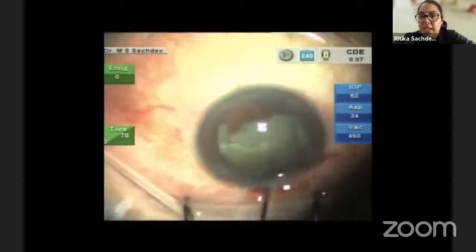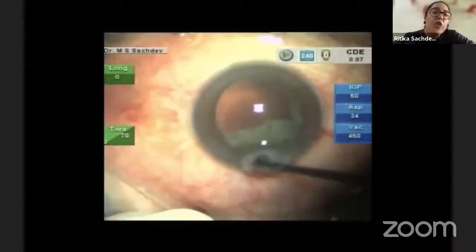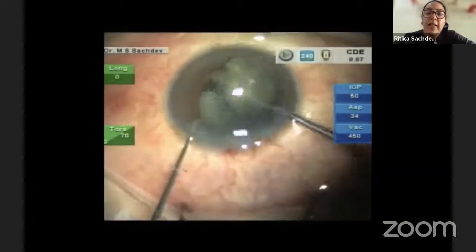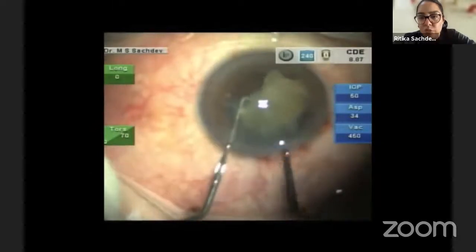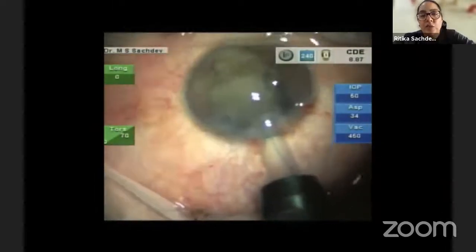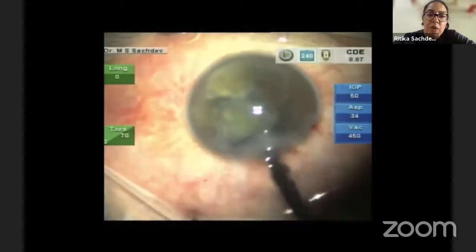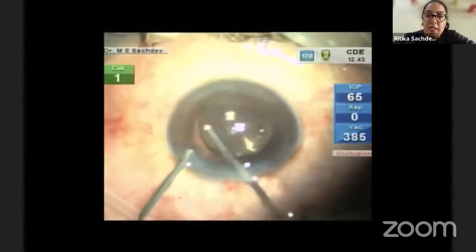The only flip side is that a femto has already segmented and softened this heminucleus, which will cause this to not come out in a single piece, which would be easier had it been the conventional method. But we still bring it up in 2 pieces, which have been segmented through the femto. Once it is in the anterior chamber, the IOL scaffold technique is going to be followed, and the 3-piece IOL will be inserted behind the nucleus pieces. Again, viscoelastic a must, between the piece and the corneal surface.